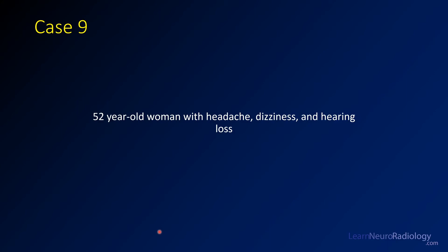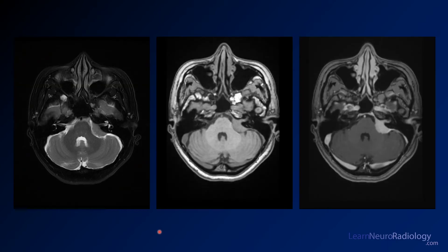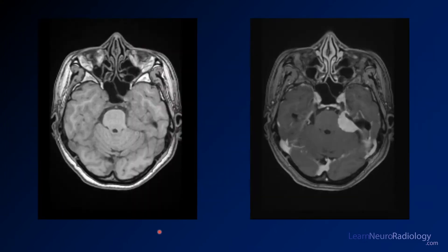A patient presents with headache, dizziness, and hearing loss. Here you see some images from the posterior fossa through the temporal bones. Here you see additional images from that level — these are pre- and post-contrast images.